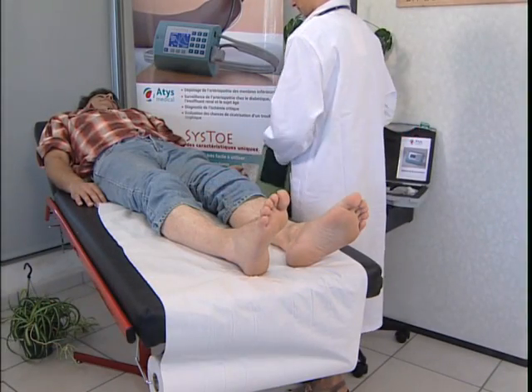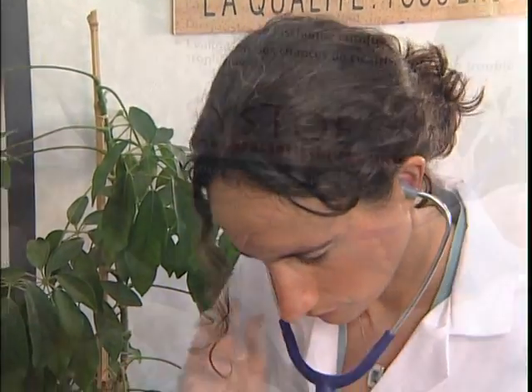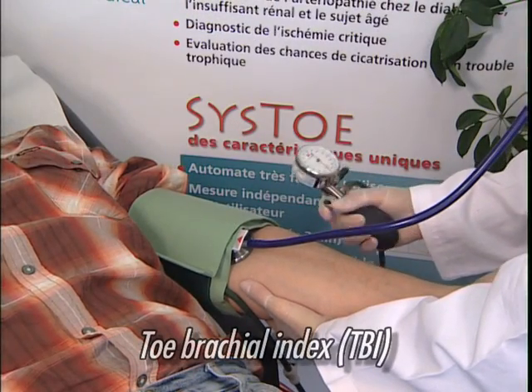After 10 minutes of rest, lying down, the patient's brachial pressure is first measured so that later the toe brachial index, TBI, can be calculated automatically.